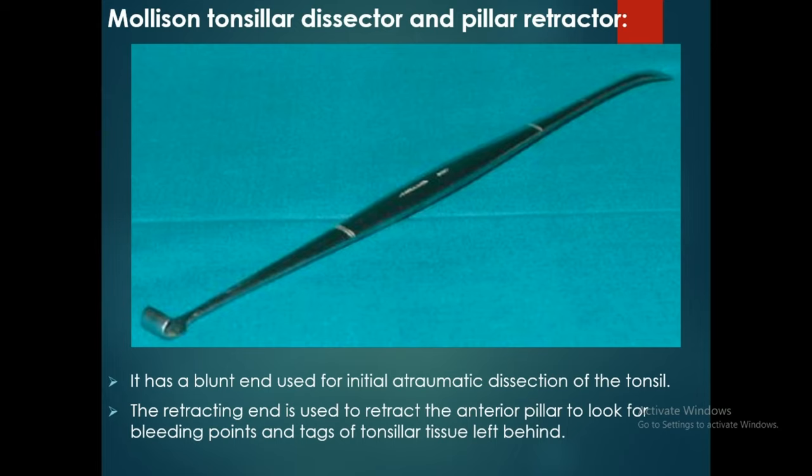Hello friends, today I will be discussing the Mollison Tonsillar Dissector and Pillar Retractor, and the Gwynne Tonsillar Dissector. Let us start with the Mollison Tonsillar Dissector and Pillar Retractor. This is the Mollison Tonsillar Dissector and Pillar Retractor. It has a blunt end and a retracting end.